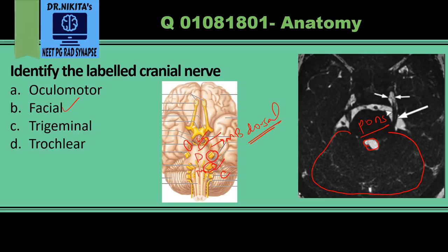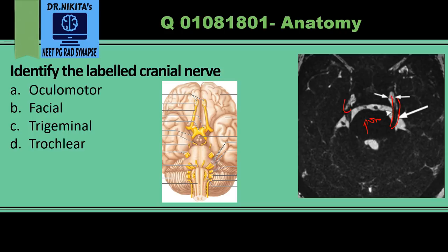Looking at the image again, this nerve is arising from the pons, it is a thick nerve, and it is going into Meckel's cave. So this is the trigeminal nerve, and the correct answer is trigeminal.